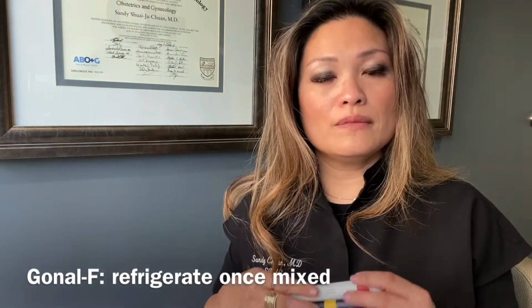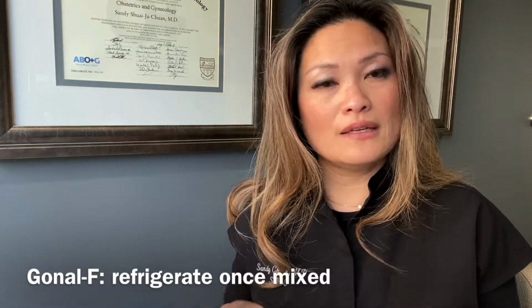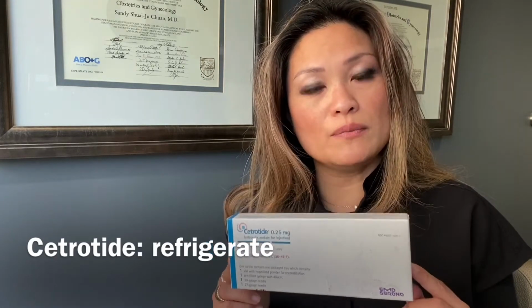For the pens, Gonal-F Pen and Follistim Pen, same thing, keep it in the refrigerator because these are already pre-mixed, and once you open it, you definitely want to keep it in the refrigerator, and it's also good for 28 days. Cetrotide, when you get that home, you will want to keep it in the refrigerator as well. It needs to stay cool, and you don't want to leave it in sunlight or anywhere warm. You want to keep it cool.